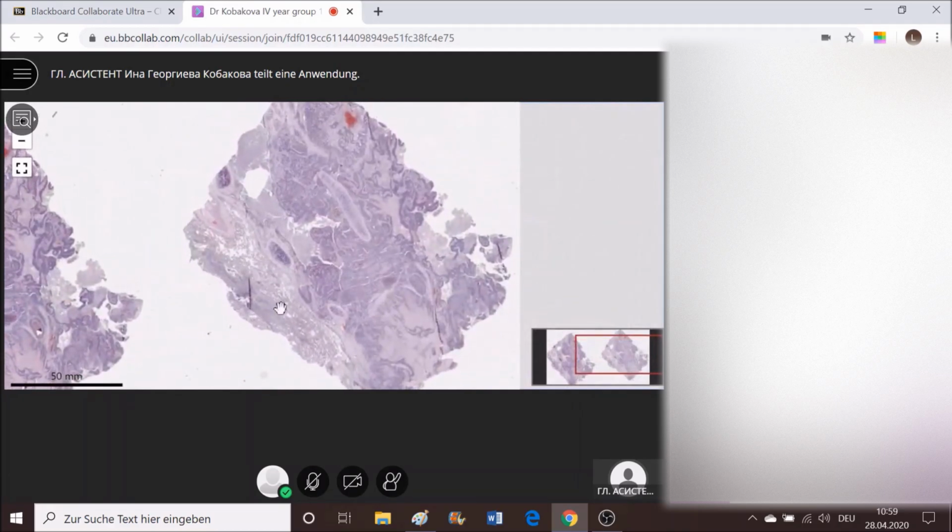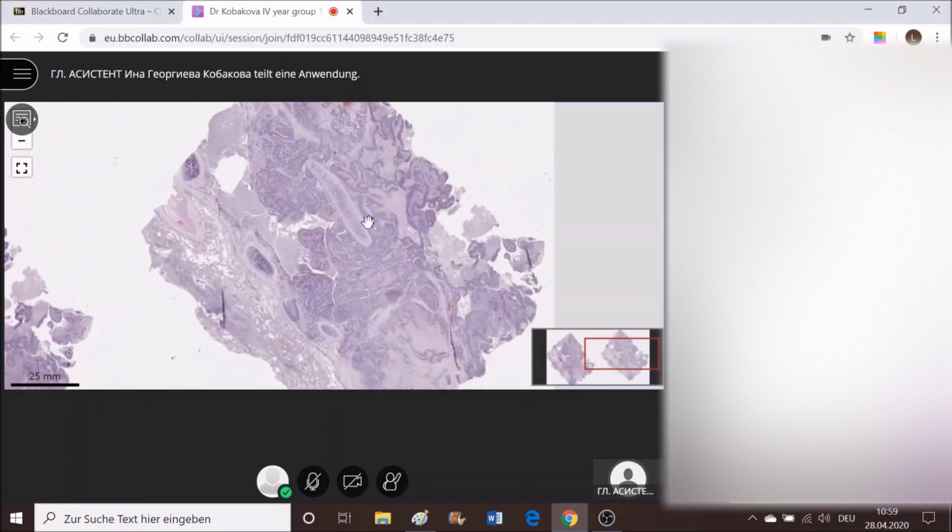that would be here the normal pulmonary parenchyma, remnants of cartilage. Cartilage is never invaded by carcinomatous growth. Carcinomas grow surrounding the cartilage structures, but they are too hard to be destroyed. Some of the very poorly differentiated structures with multiple necrosis might be able to do it, but most of the times cartilage is spared in between the carcinoma nests.